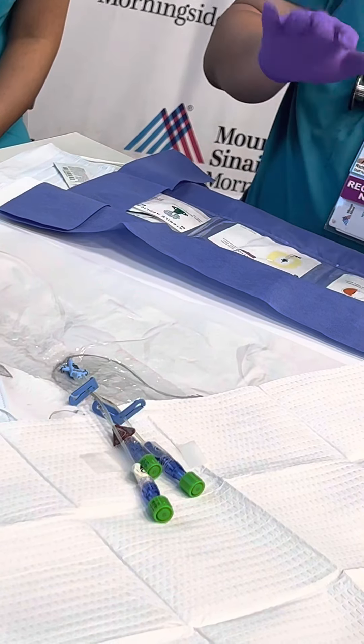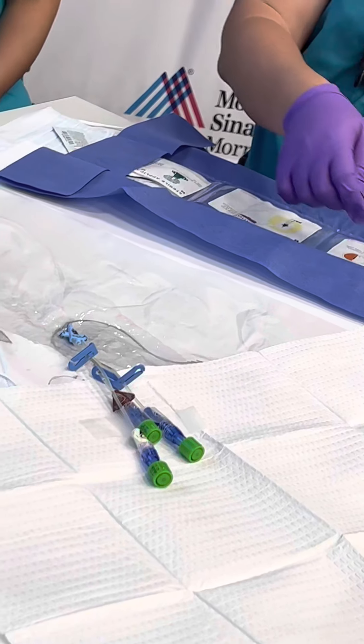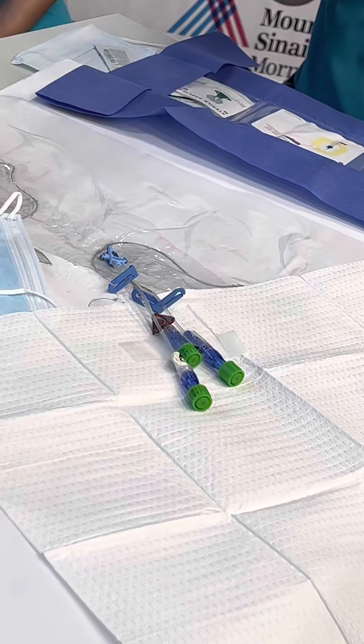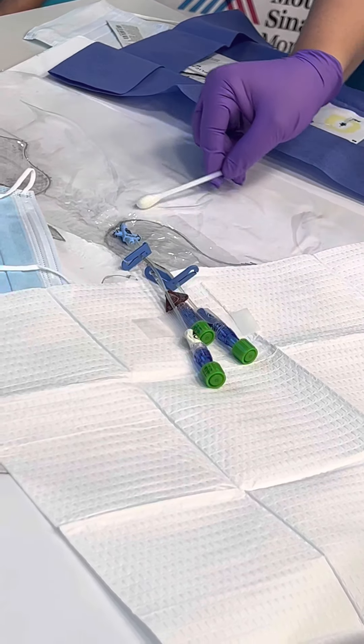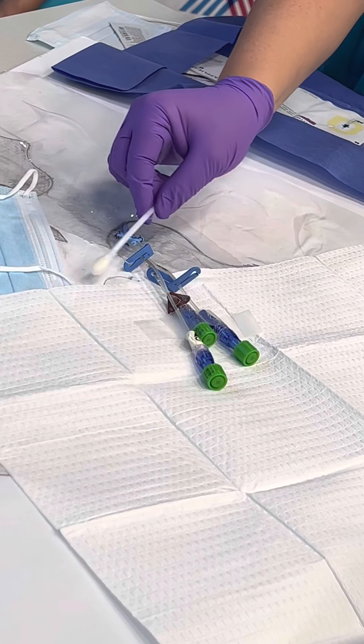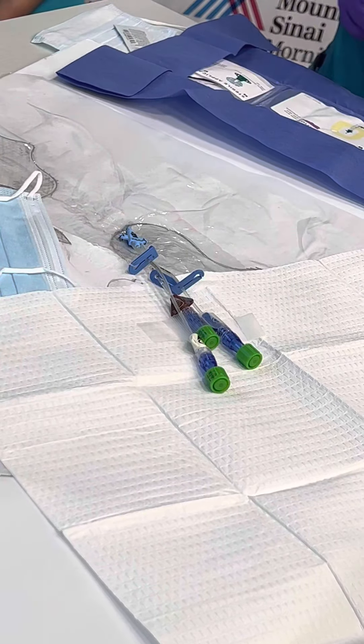So what is this stuff? Some adhesive skin barrier. We want to make sure that we let our chlorhexidine scrub dry first — it'll take about 30 seconds to dry. This one you place around the perimeter, right where your Tegaderm is going to lie.